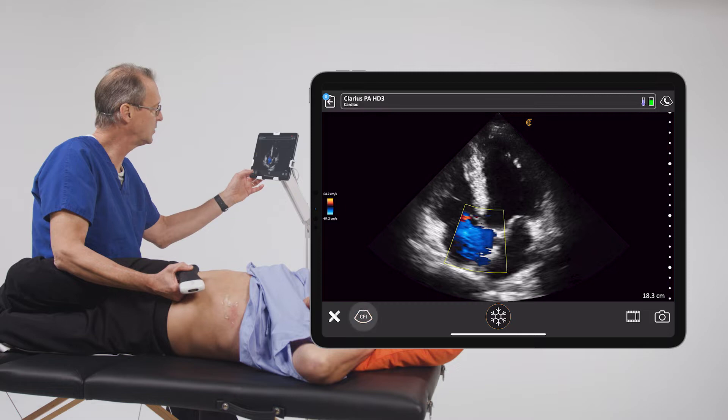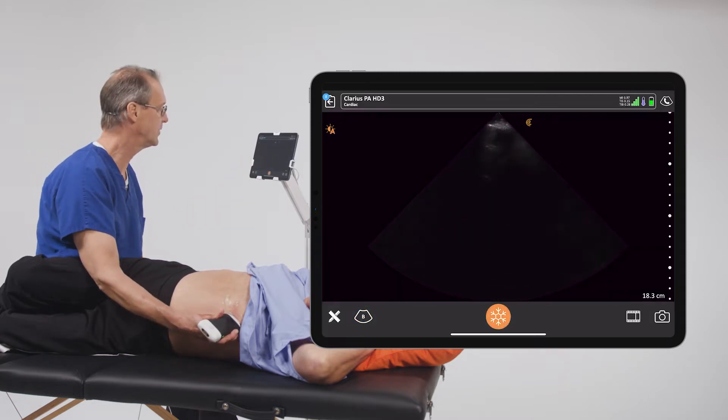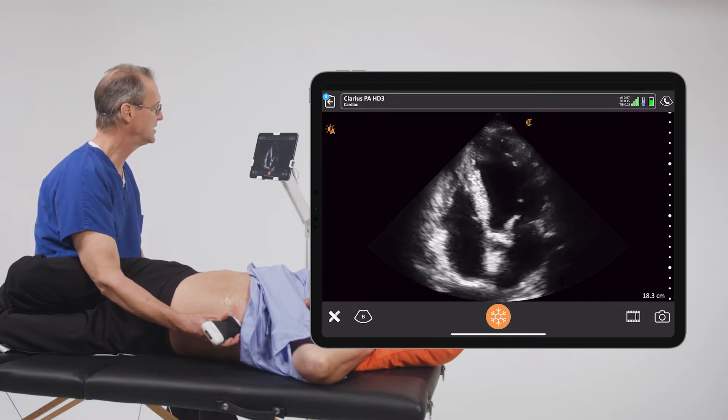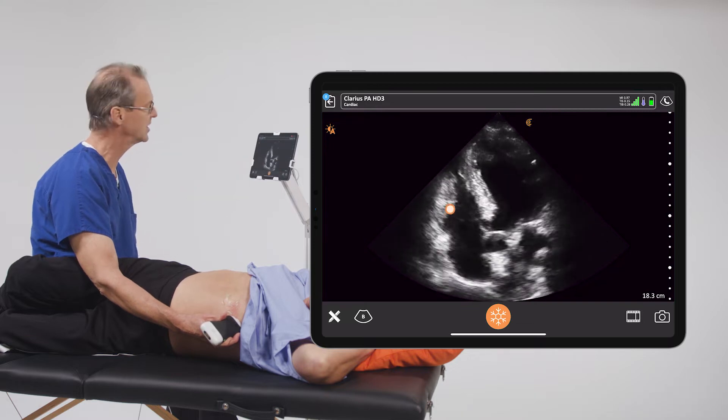To get started, we're going to use a B-mode image and get an apical four-chamber view of the heart. And as you can see in this particular image, the right side of the heart is here and we can clearly see the tricuspid valve.